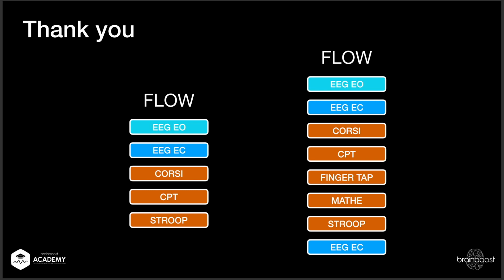As a thank you, because I also want to give you the chance to ask questions, we give you some flows we use and I created. The first one is a short one, so we have an eyes open, 3 minutes this time, eyes closed, and we do the Corsi test, the CPT, and the Stroop test. And Stroop is also a lot of research on that. These are pretty cool tests. And then I will also give you a flow that has all 5 tests, eyes open, eyes closed, and at the end, eyes closed. I think these are also nice when people say, well, when I had a stressful event, I want to regenerate, my brain doesn't shut down or it's going crazy. So maybe prefrontal, frontal part of the brain, take a look at that.